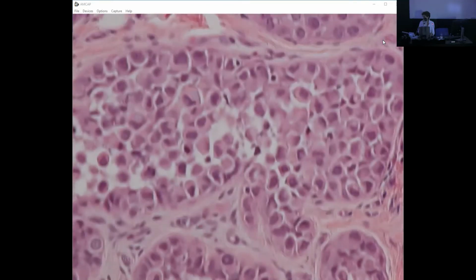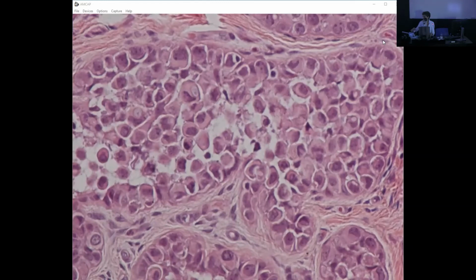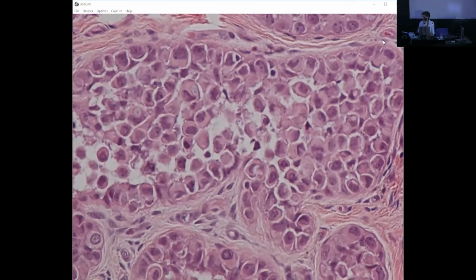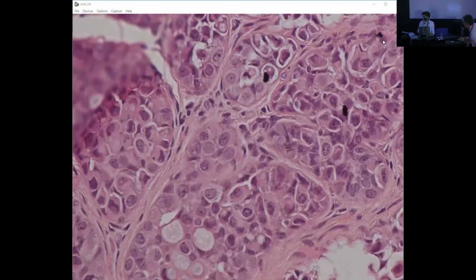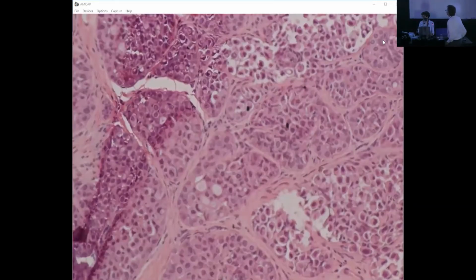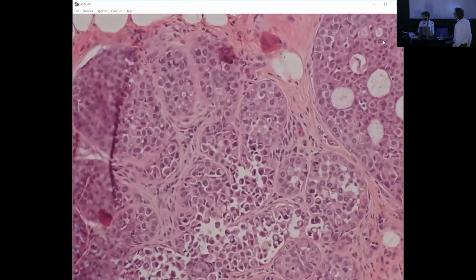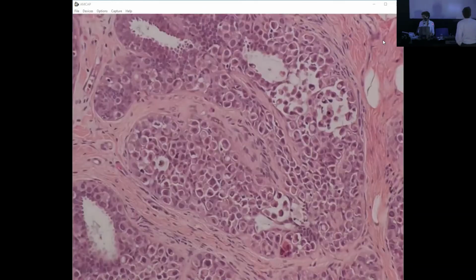It's a judgment call. Would you call it pleomorphic, Laura? Yeah. So in this focus, there is some focal pleomorphic LCIS together with classic LCIS in collagenous spherulosis. A unique case because it's a very uncommon combination.